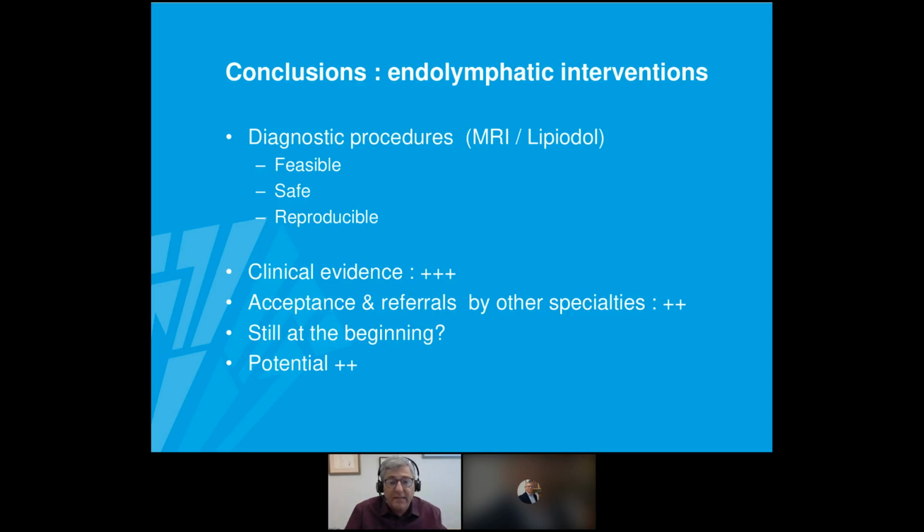Then your access at the right liver lobe might already be occluded. Sometimes you might have a formation of new lymphatics, but if there are no new lymphatics which can be targeted, then you can also do the puncture at the proximal left portal vein.